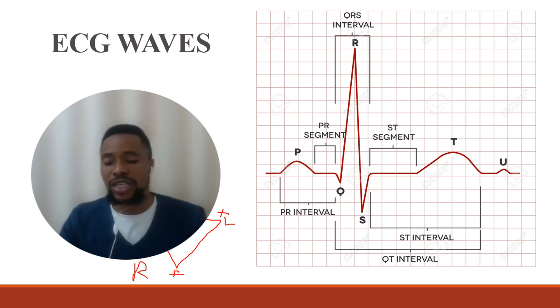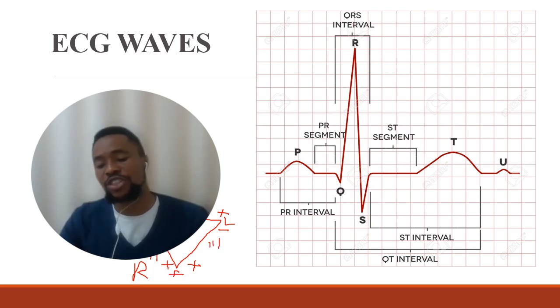Lead 1 is one of the leads that you see on your ECG. Then you have lead 2, formed from the negative charge from the right hand and the positive charge from the foot. Then you have a positive charge from the foot and a negative charge from your left hand to form lead 3. So this is what Einthoven's triangle means. Now, lead 1, lead 2, and lead 3 are called bipolar limb leads. They are the only bipolar leads.